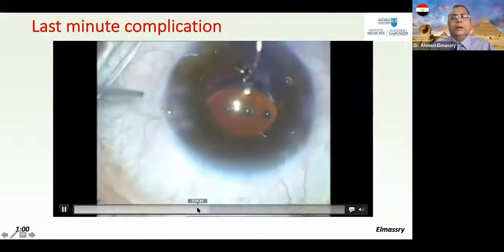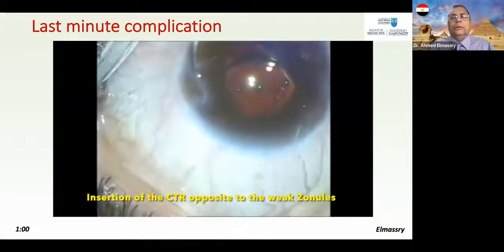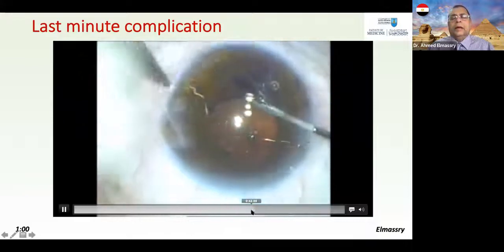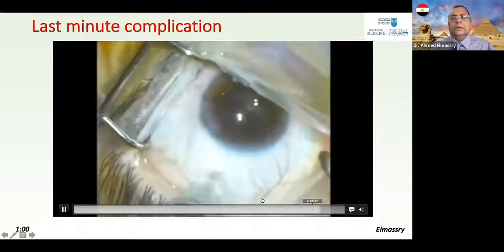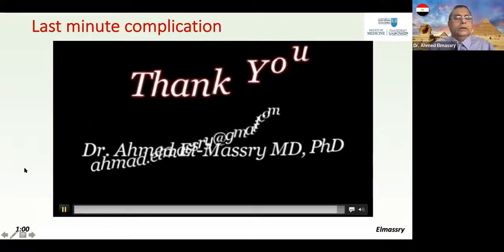Mind widening of the main wound, and insertion of the capsular tension ring inside the bag around the lens will stabilize everything and return the situation to its original position. This patient also had an intravitreal injection during the surgery, as he was a diabetic patient.